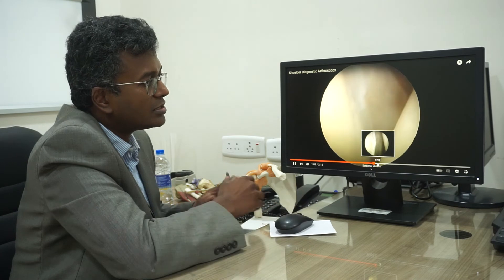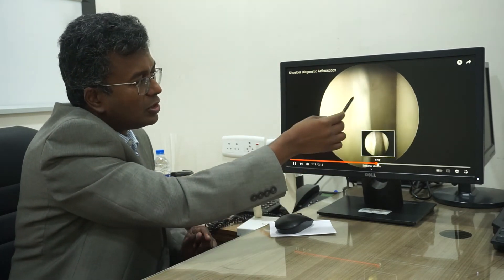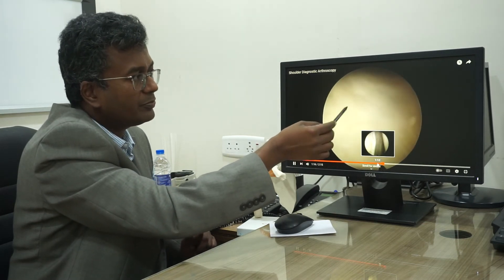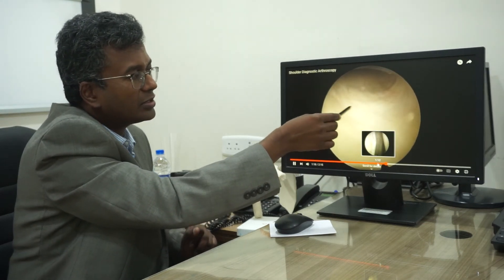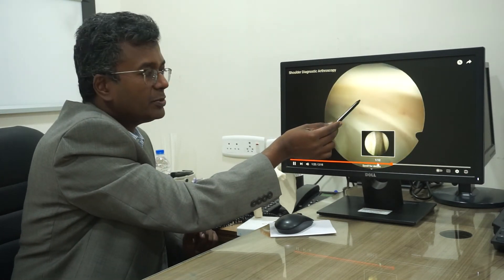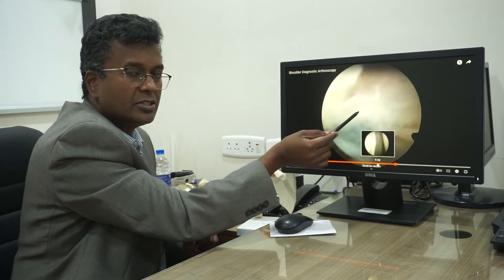This is a normal labrum — in a dislocated shoulder it would be torn. This is the inferior capsule. The HAGL lesion — humeral avulsion of the glenohumeral ligament — occurs here, where the ligament detaches from its humeral attachment.